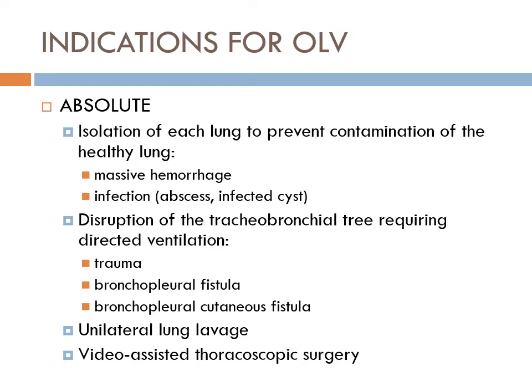and the tube is one circle, but just for demonstration purposes, I'm going to show you that there's a little port that's right here. Just like a normal tracheal tube would have been right here, there's a port so that you can ventilate through the right side or you can ventilate directly through the left side.